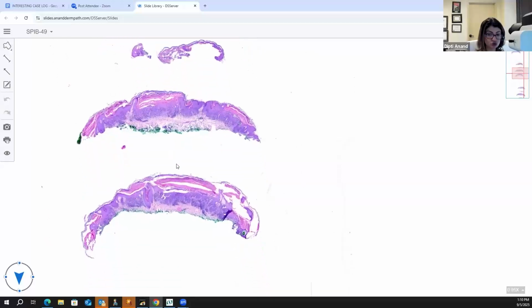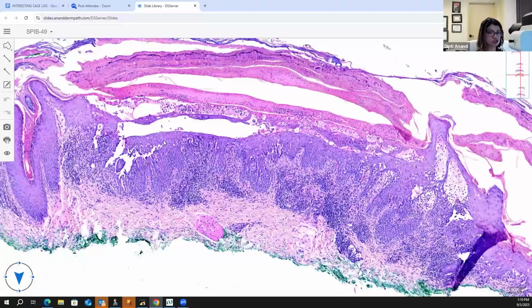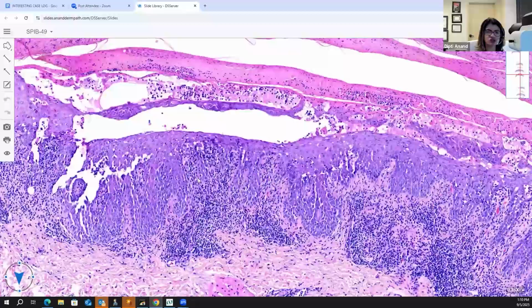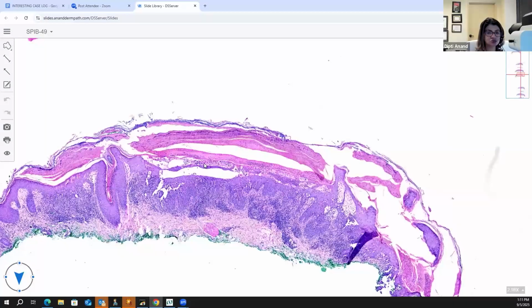There is often erosion and crust because of the location of the disease. And this is not unique to you. Even we sometimes will struggle. Are we dealing with a necrotic process, or are we dealing with an acantholytic process? Because what is there in Darier's? It's acantholytic dyskeratosis, right? So then you have to back down and look at the facts. First of all, things like EM and fixed drug eruption never produce epidermal acanthosis. If this was the back of the hand, you would understand, right? That's thick because of the location. But those interface diseases like EM and fixed drug eruption don't induce epidermal hyperplasia, because they are acute diseases. So the epidermis is thick because of the disease process here.